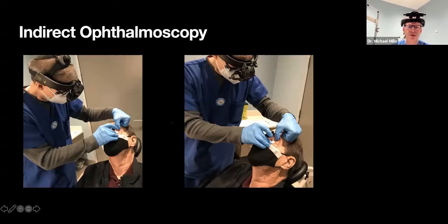And it is important to dilate the pupil and take a look, because you can have a retinal tear. I actually had a patient this morning who I had seen previously who was having intravitreal injections for a branch vein occlusion, good vision at 20/30. She received two injections, then developed a PVD with some floaters and had a retinal tear and lattice. I stopped the injections and lasered her. I restarted today because she had recurrence of the fluid, but it is extremely important to take a look. If I hadn't seen that and had continued with the injections, potentially the patient would have had a detachment.